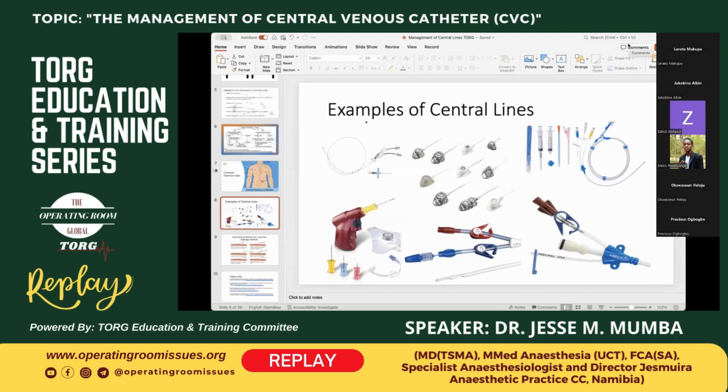The other patients that can go home with the central line are the ones who have a temporary pacemaker. So the sheath is left in, the pacing wire is left in, and they go home with the pacing box, waiting for the permanent pacemaker to be inserted. But all other central lines need to be removed.